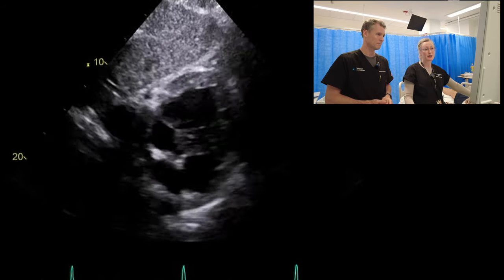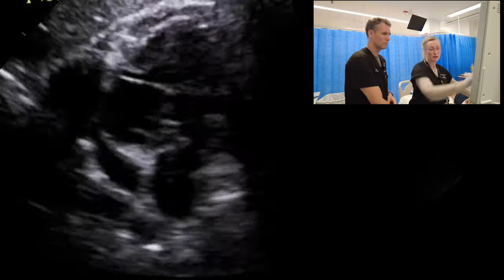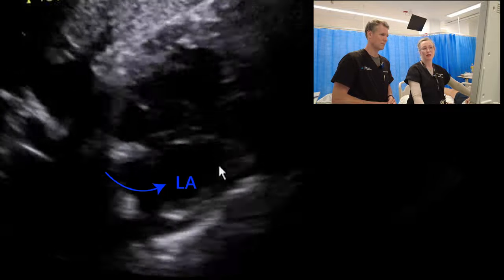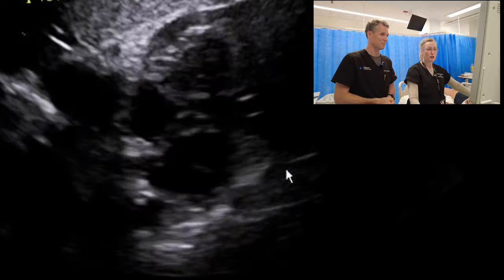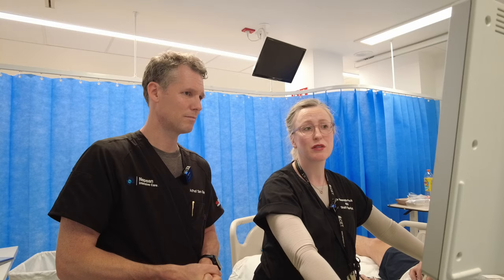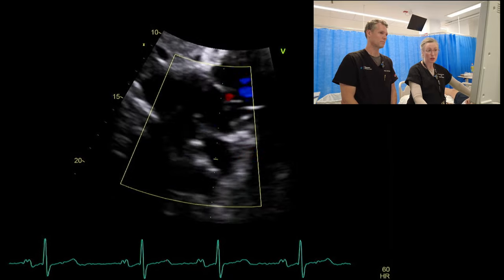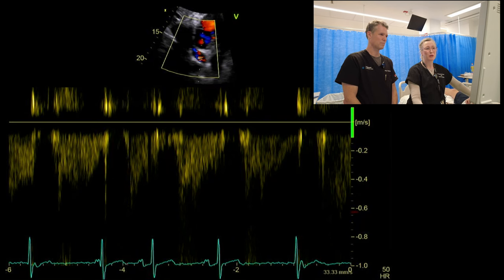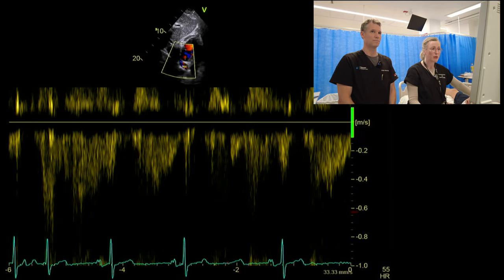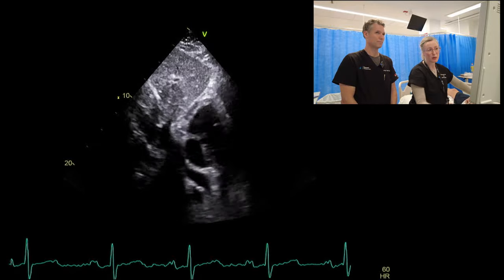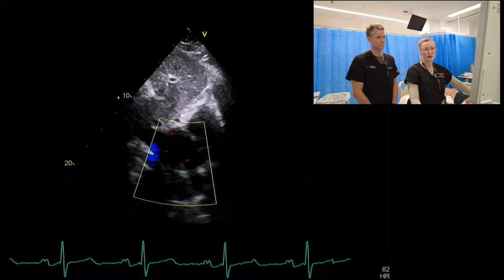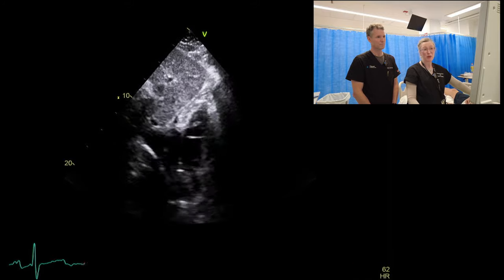What we can see here is the baffle from your SVC and IVC — deoxygenated blood coming into this left atrium — and there's no communication with the right atrium or the systemic atrium. Popping some colour on that, turning the scale down to what you'd normally use for venous flow, and putting pulse wave Doppler through that as well. You'd see flows less than one metre per second that return to baseline. If you're seeing continuous flow through that you would worry about obstruction. Following it up with 2D and colour, looking for any turbulence or arterial-type flow suggesting obstruction — and we're not seeing that, though we're not getting perfect views of the baffle.